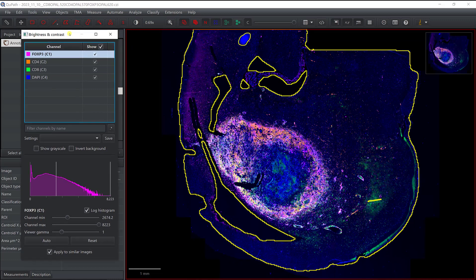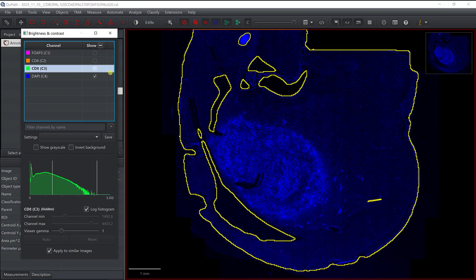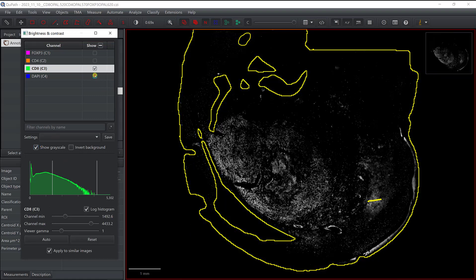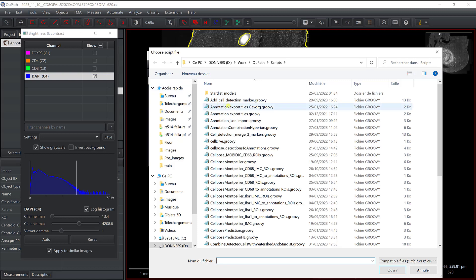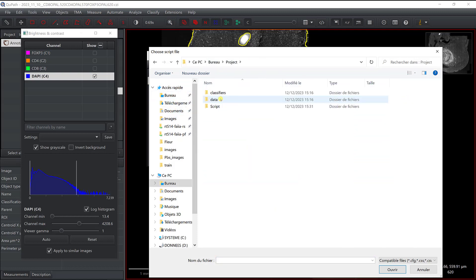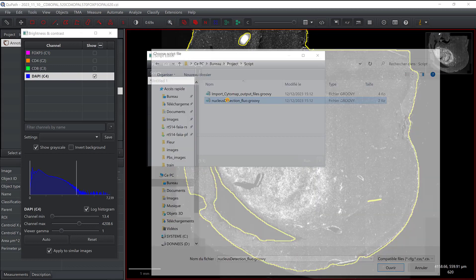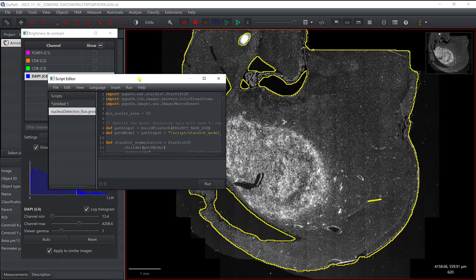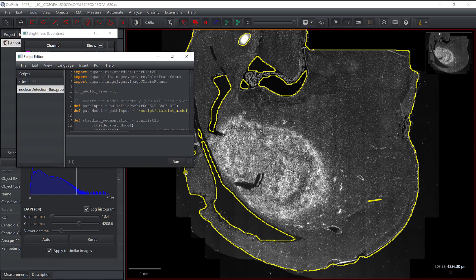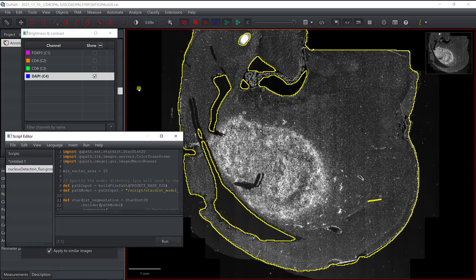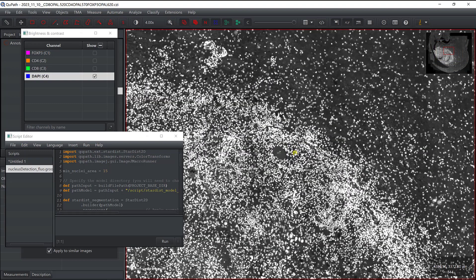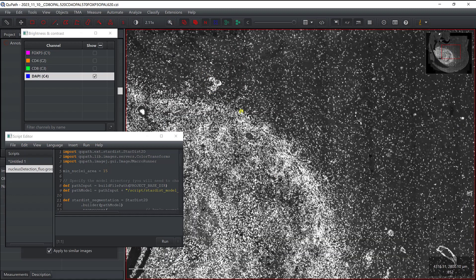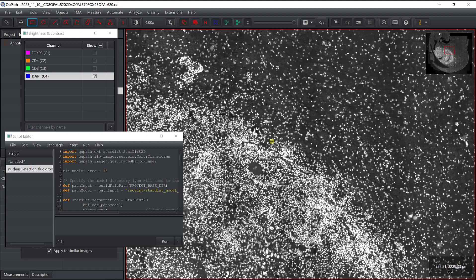I'm going to work with just the DAPI channel since that's what we need for detection. I'll open the script editor from the new version's interface, navigate to my project's script folder, and open 'nucleus detection flow.groovy'. I'll first work on the parameters using a small test annotation that includes both tumor and non-tumor regions to see how the model performs.